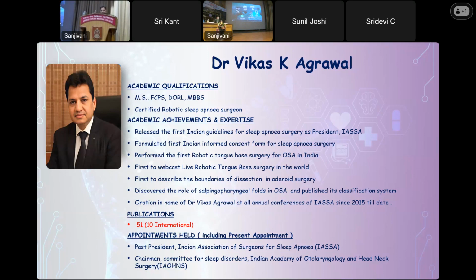Now, this is important. This works only on the peripheral arterial tone, which is altered because of the disturbance in sleep and the oxygen saturation. So this gives sleep stages. This gives the autonomic nervous system response. This is AI. This is purely AI, and this will transform.